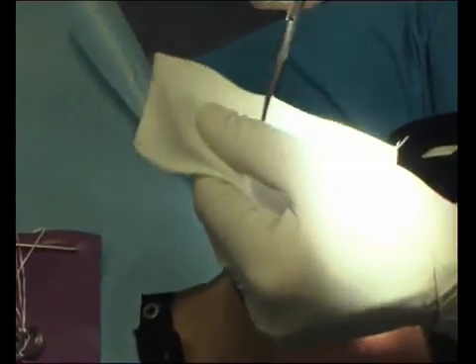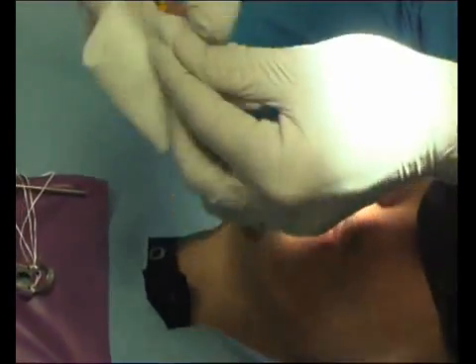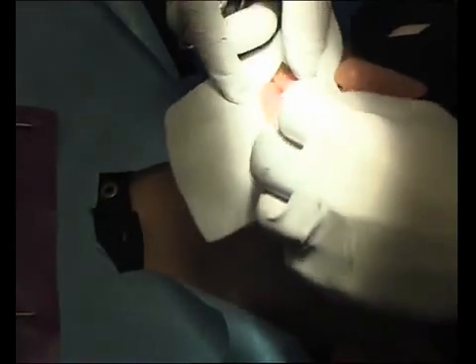Fold the rubber dam in half, the gauze in half. Take the scissors. You've got a little hole — patients breathe through down there. Some patients find this more uncomfortable than to rub it out themselves.